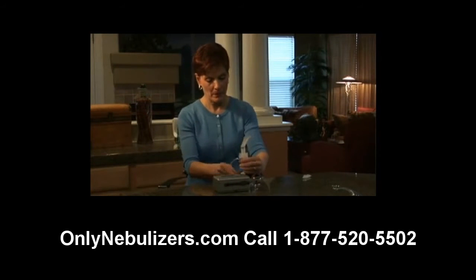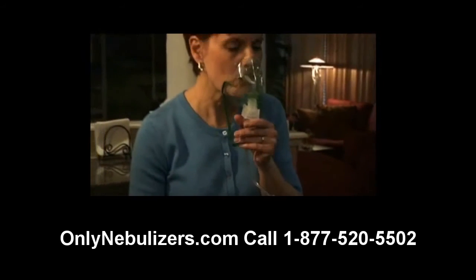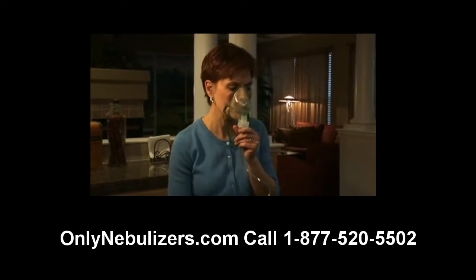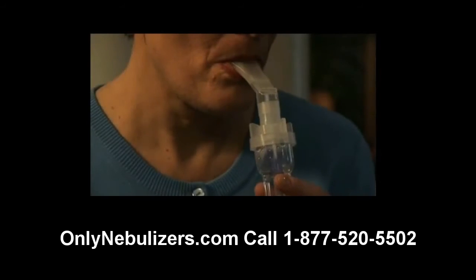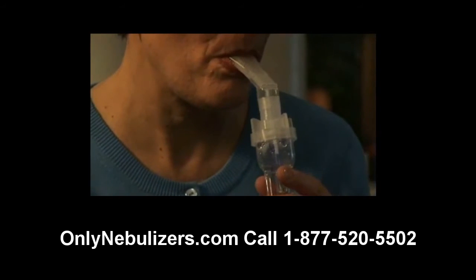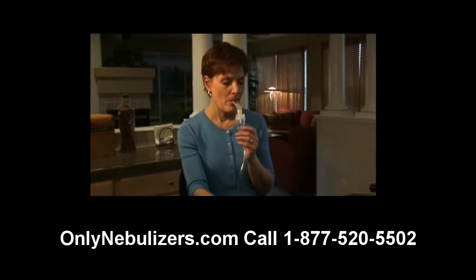Please note that you may need to use the nebulizer holder adapter bracket to accommodate your nebulizer. If you're using an aerosol mask, place it over your mouth and nose. As aerosol begins to flow, inhale deeply and slowly through your mouth, then exhale slowly. Please note that medication can collect on the sides of the nebulizer during treatment. If this happens, gently tap the nebulizer and the medication should drop back into the cup.